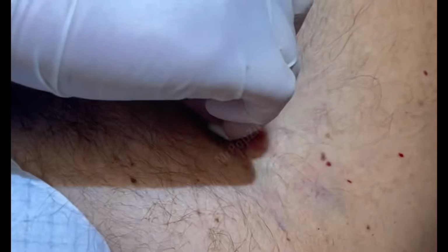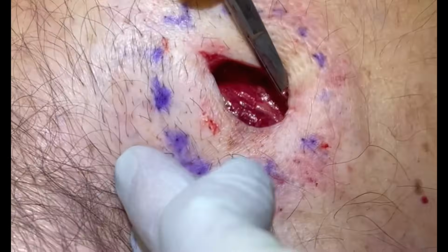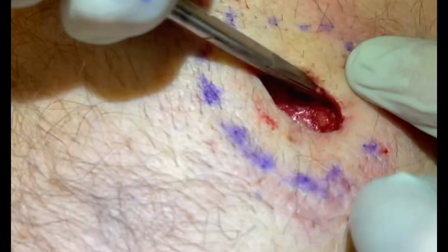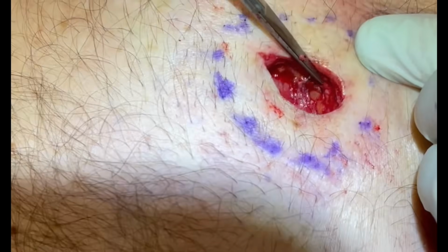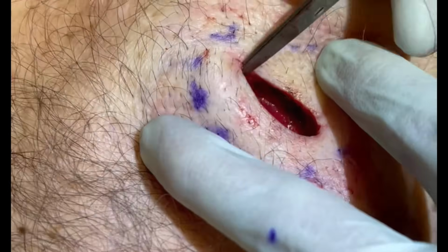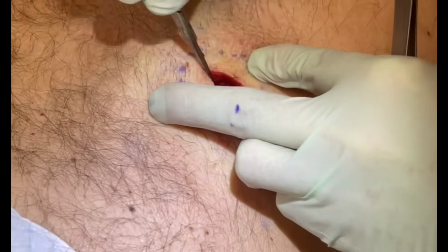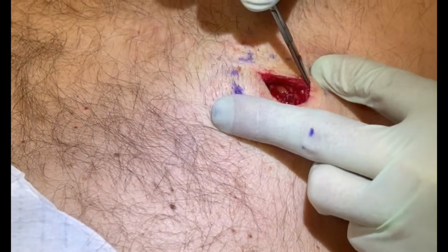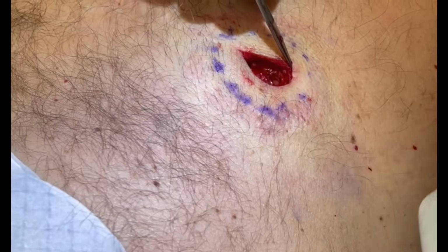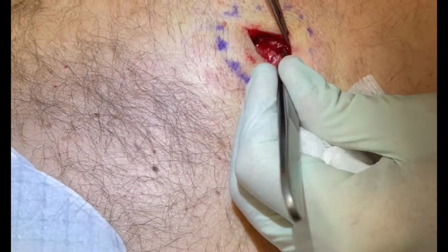You can see here, when we pull that open, just some fat tissue and fascia. No real bleeders either. That's fascia over the muscle there. And we look around, there's a couple tiny little dark spots that are remnants I'm going to get out for him. Did have what felt like scar tissue around it too. I have seen hematomas look just like that, and they kind of solidify almost into a hard cyst. So no history of trauma though, but we're going to check that.